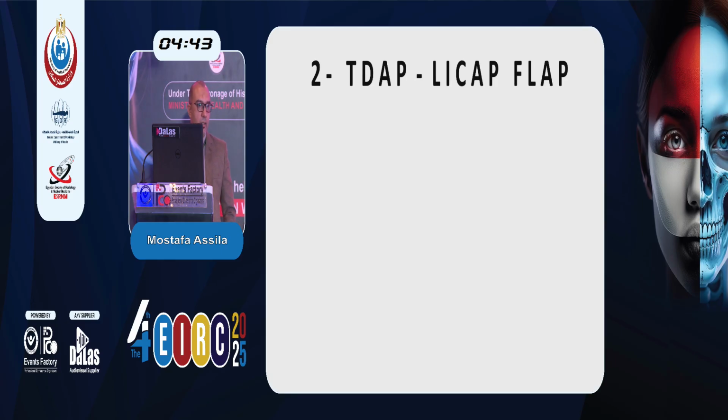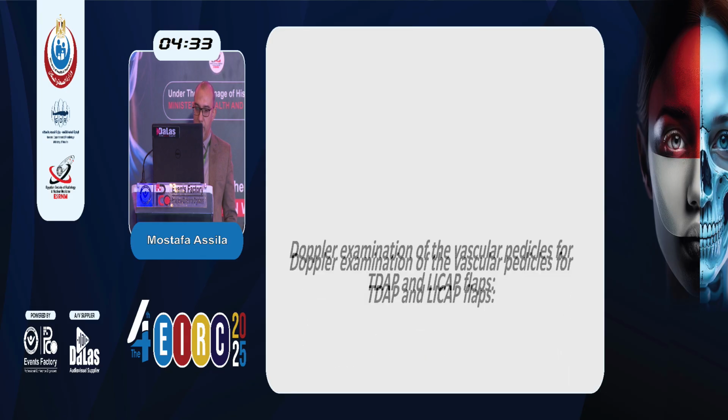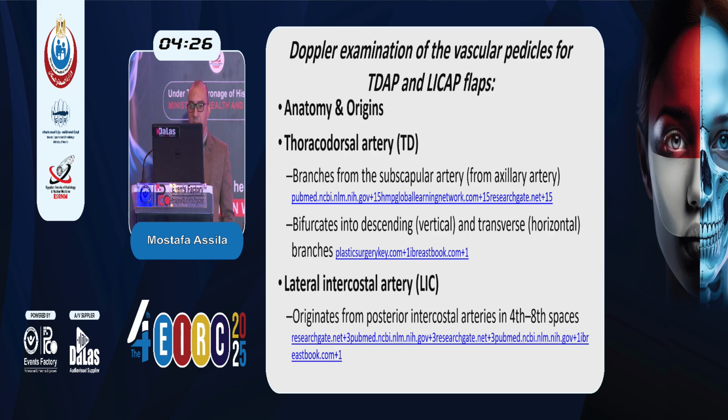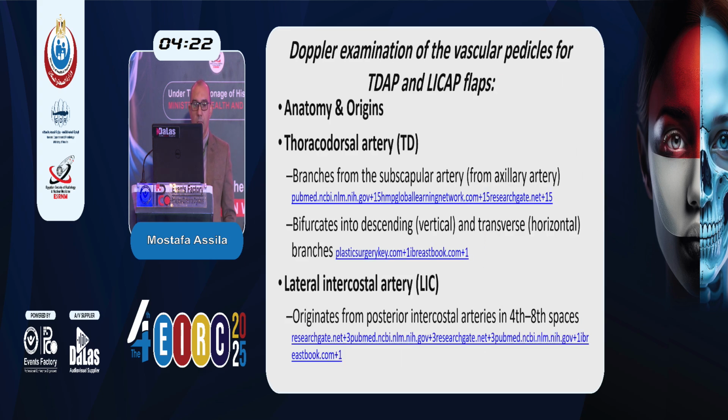Second, we will talk about the thoracodorsal artery perforators and the lateral intercostal artery perforators. Unlike what we saw in the previous picture, here is the Doppler examination of the vascular pedicle. The thoracodorsal artery is mainly used for reconstructive surgery of the breast.